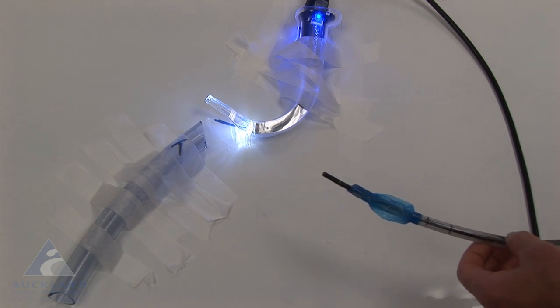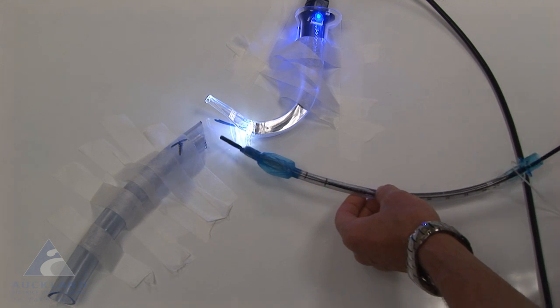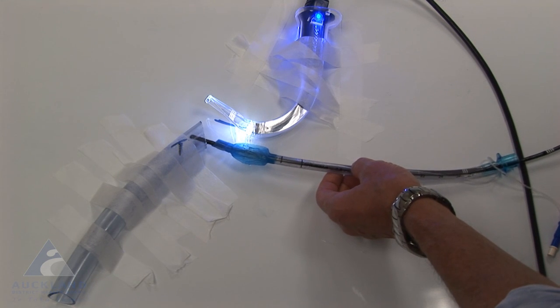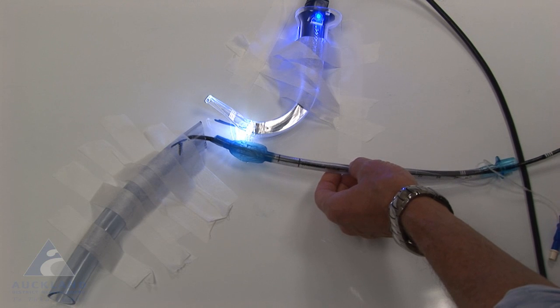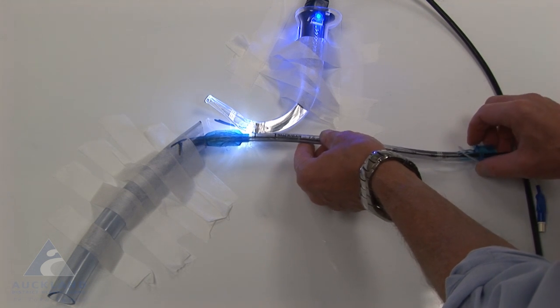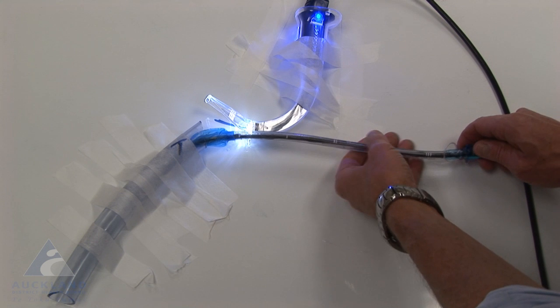The next image shows the use of a fibre optic scope in combination with a video laryngoscope. The fibre optic scope is advanced to the cords in a fairly standard fashion, and then the tip is directed posteriorly down the trachea. Next, a suitable flexible tube is advanced over this fibre optic scope down the trachea, and this is usually made much easier with a twisting motion, as you will see in the following video.